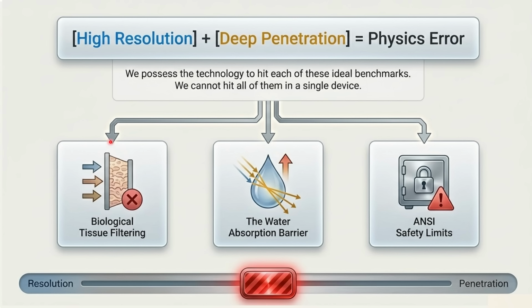If total absorption happens, this will create a high temperature inside the eye, and this will be against the safety rules and boundaries made by the ANSI regulation for the use of the laser beam inside the eye. So you cannot use a 1500 wavelength of the laser beam. This will create high temperature inside the eye.